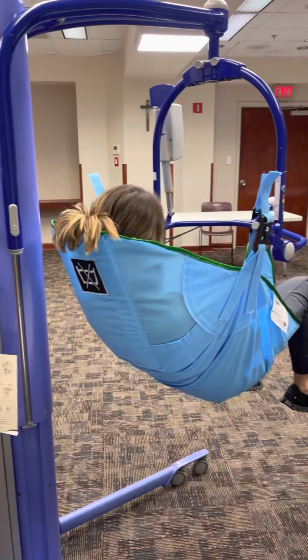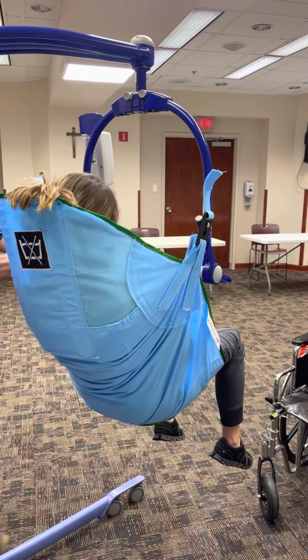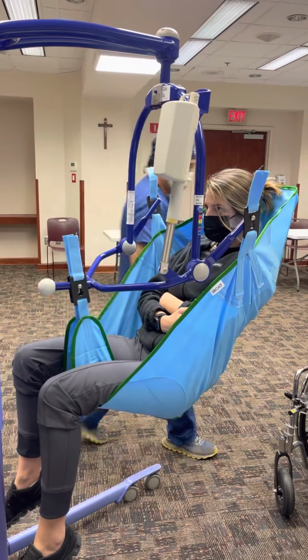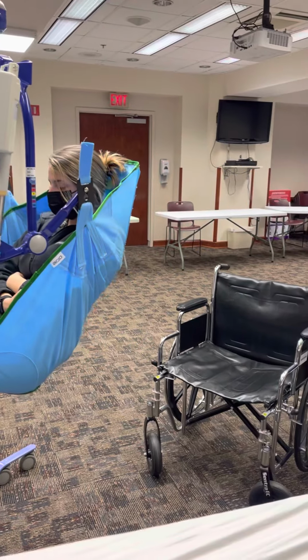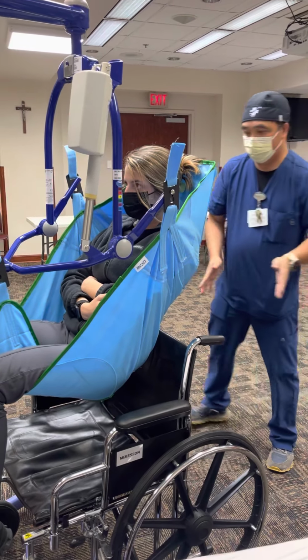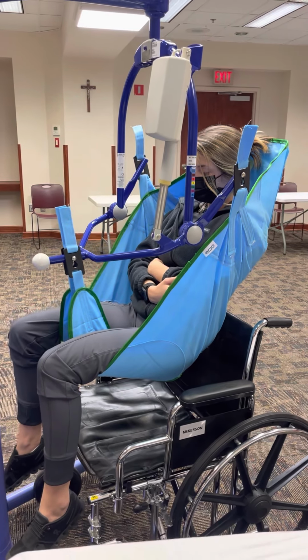I'm gonna set her up a little bit more, because I'm gonna turn her around like this, so we can clear the knees from this bar right here. And since I'm moving her to a wheelchair, I can move the wheelchair under her. If it's a recliner, you have to move the lift towards the recliner. And then I'll lower her. I'm going to set up a tiny bit more and lower her down.